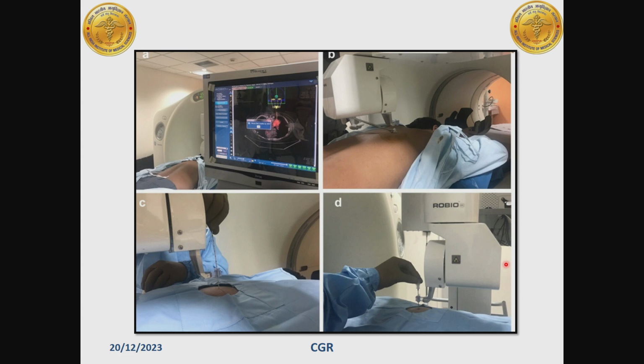The patient is confirmed for comfort, and again a check CT is done. Now, this check CT is to find out whether there are any associated complications like hydrothorax, hemoperitoneum, hemothorax, or pneumothorax. Once this risk is ruled out, the patient is sent to the department which referred to us for a few hours of observation.